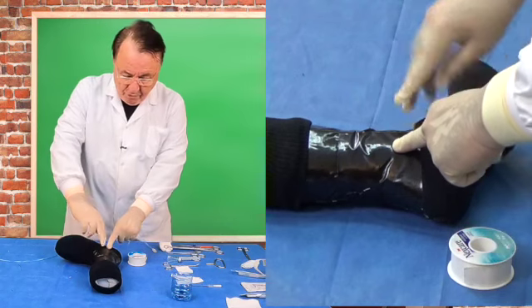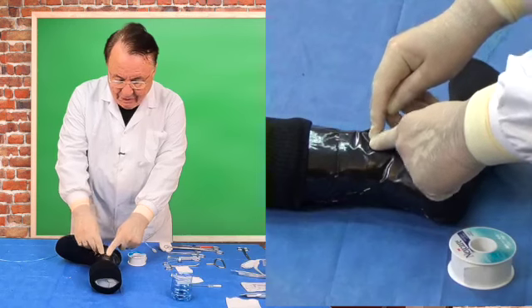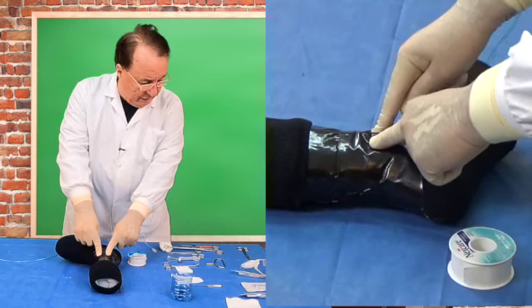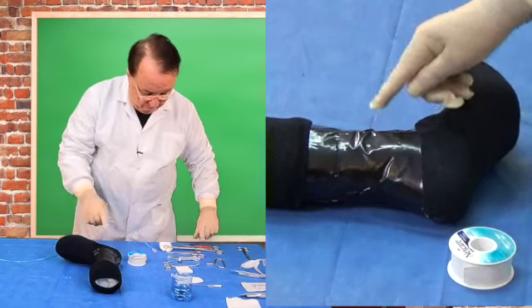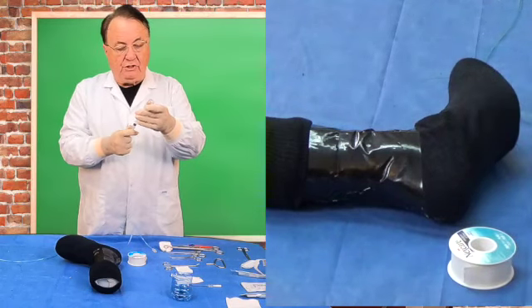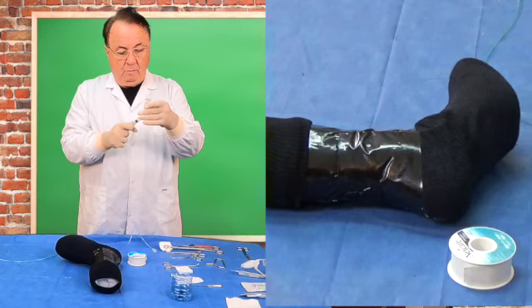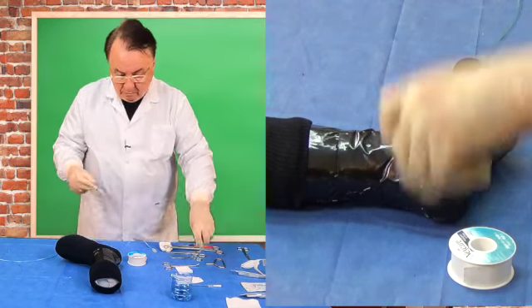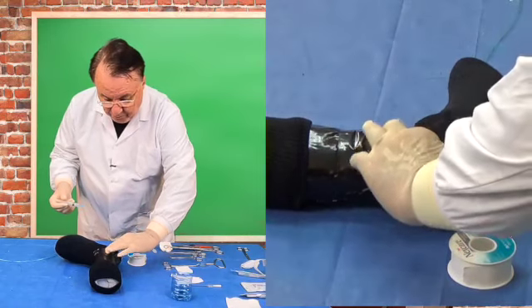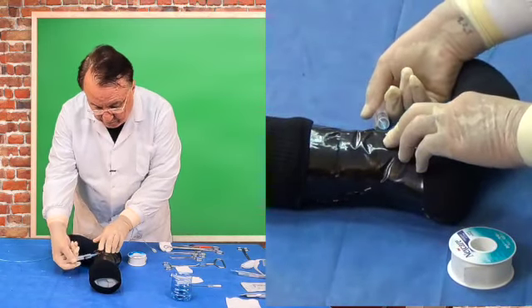From here, you go 2 finger breadths up and 1 finger breadth across, and that is the site of where you make an incision. So, let's give some local anesthesia at this point. Again, 2 fingers up, 2 fingers anterior, and we infiltrate the skin.